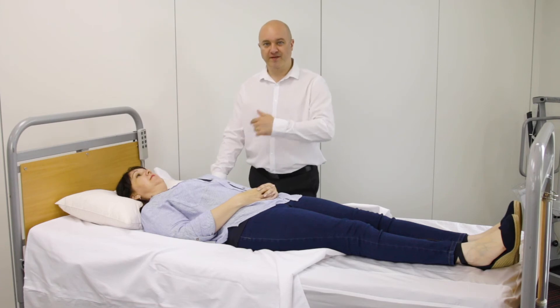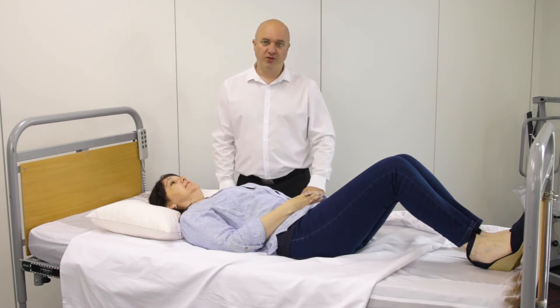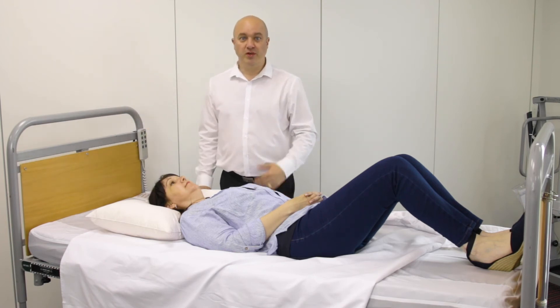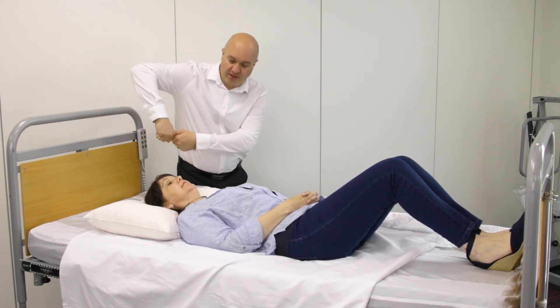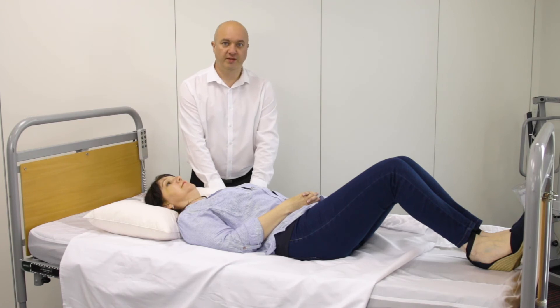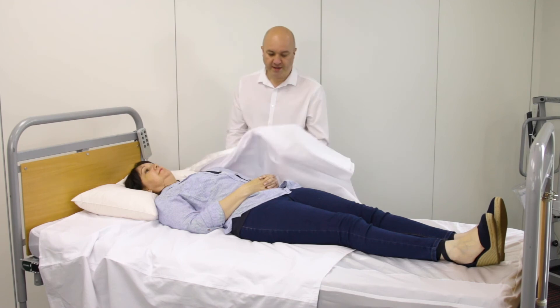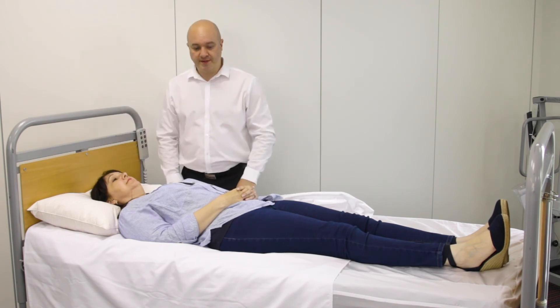I'm going to show you how to move Sarah up the bed. I'll ask Sarah to shuffle down — as if by magic, Sarah has now gone to the bottom of the bed. If we came in and found Sarah in this position, we would untuck the sheet, which we already have done. For single-handed care, we want to avoid trying to get Sarah straight up the middle of the bed, as the only way to do that is to twist, trying to pull up the centre. So we're going to break it down into two manoeuvres: take the top sheet at Sarah's shoulder and pull straight back, almost putting the shoulder to your tummy, pulling Sarah up the bed into the corner. Then we can put Sarah back in the middle once she's up the bed, instead of doing that twisting manoeuvre straight up the centre. It makes life a lot easier.